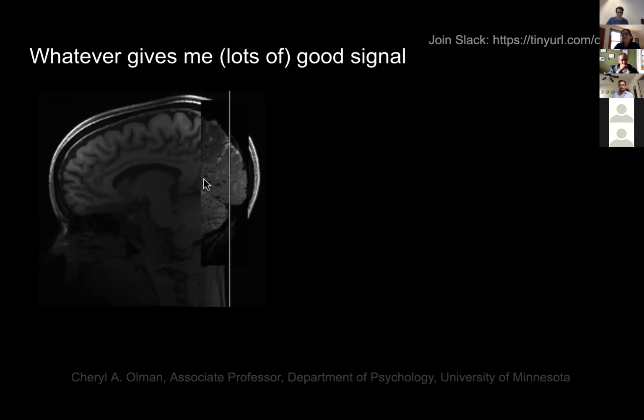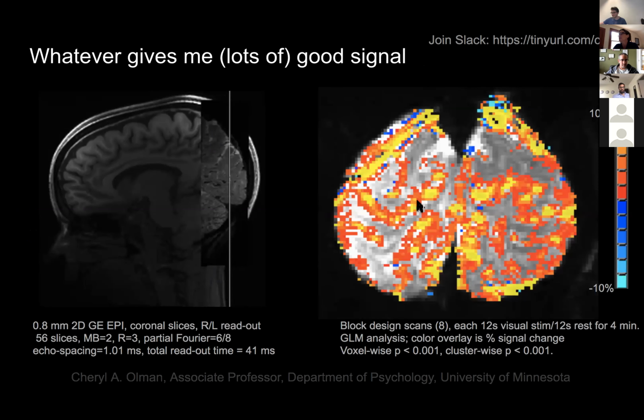All right, so I've always studied vision, which means that it's very likely on any given experiment I'm acquiring coronal slices in posterior cortex using some kind of an open-faced surface coil. For a long time, all of my high-res work was either spin echo or GRASE, because I greatly fear large veins, and when I see these high beta weight regions in my image, my first thought is that is the signal that I don't want. But gradient echo EPI does have a lot of advantages when it comes to the trade-offs that we need to make between coverage and acquisition speed and power deposition and contrast to noise ratio.